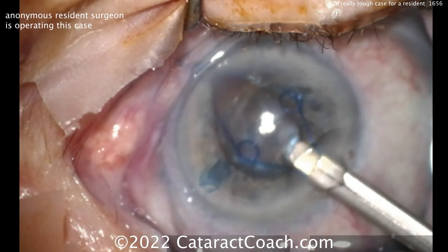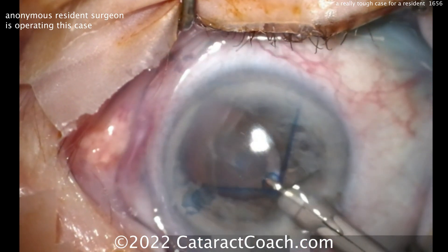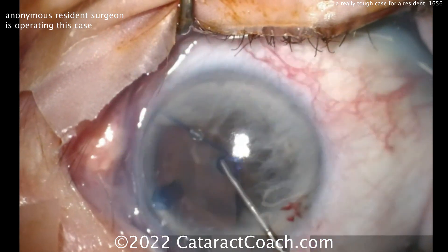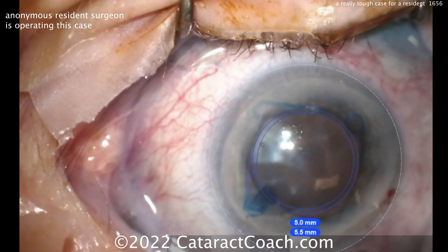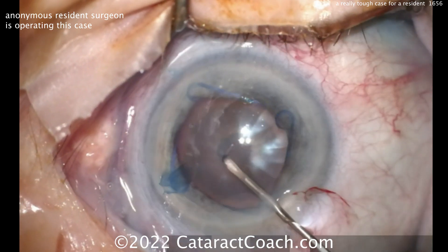By the way, your Callisto overlay on the screen is driving me bananas — but thank you. We'll put that inside the eye. Here's where you want to use two hands. Two hands is helpful as you inject with the right hand — your left hand could have been in the side port, entering there and helping guide the scrolls to get them in place. Now you've got about a 5- to 5.5-millimeter opening there.